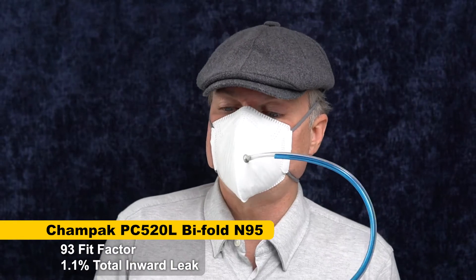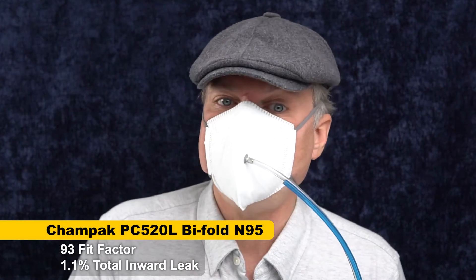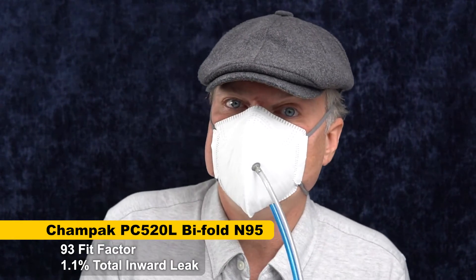The result is 93 — actually a similar score to the 3M, but I feel like it fits a lot better. Even if the score is not better, it's a more comfortable mask for me, and it just feels like it has more potential to fit well.